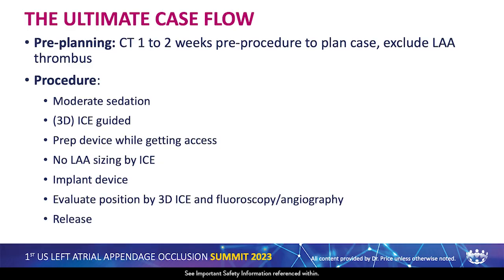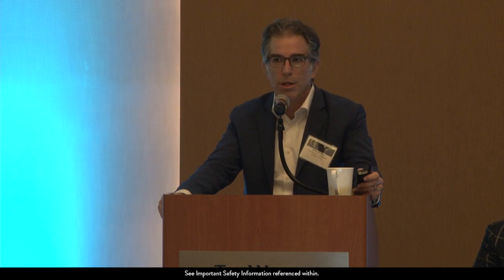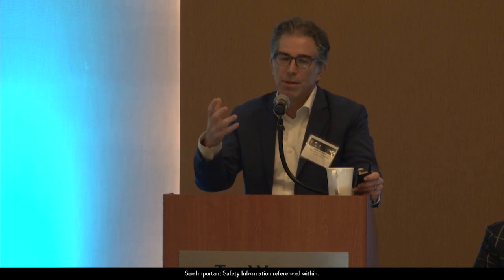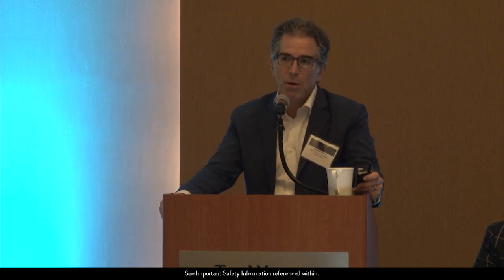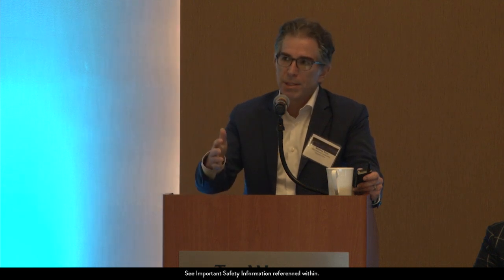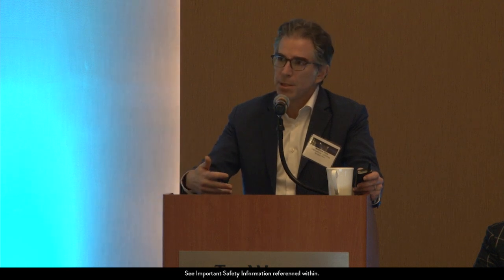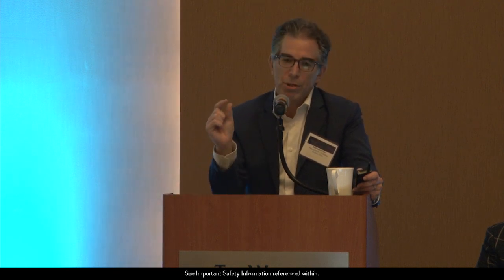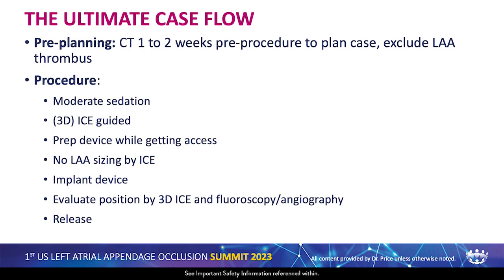So CT planning 1 to 2 weeks before the procedure to exclude LAA thrombus. I think that getting an RVOT view can be challenging in older patients with large atria or LV dysfunction and rotation of the heart, and I see a lot of older patients with multiple comorbidities. So I like to do a CT and then keep OAC on until I have them stop a couple of doses, so it's not therapeutic, but have a very short span of not being covered, so the likelihood of thrombus is very low. Procedures with moderate sedation, 3D ICE guided, we'll talk about that.